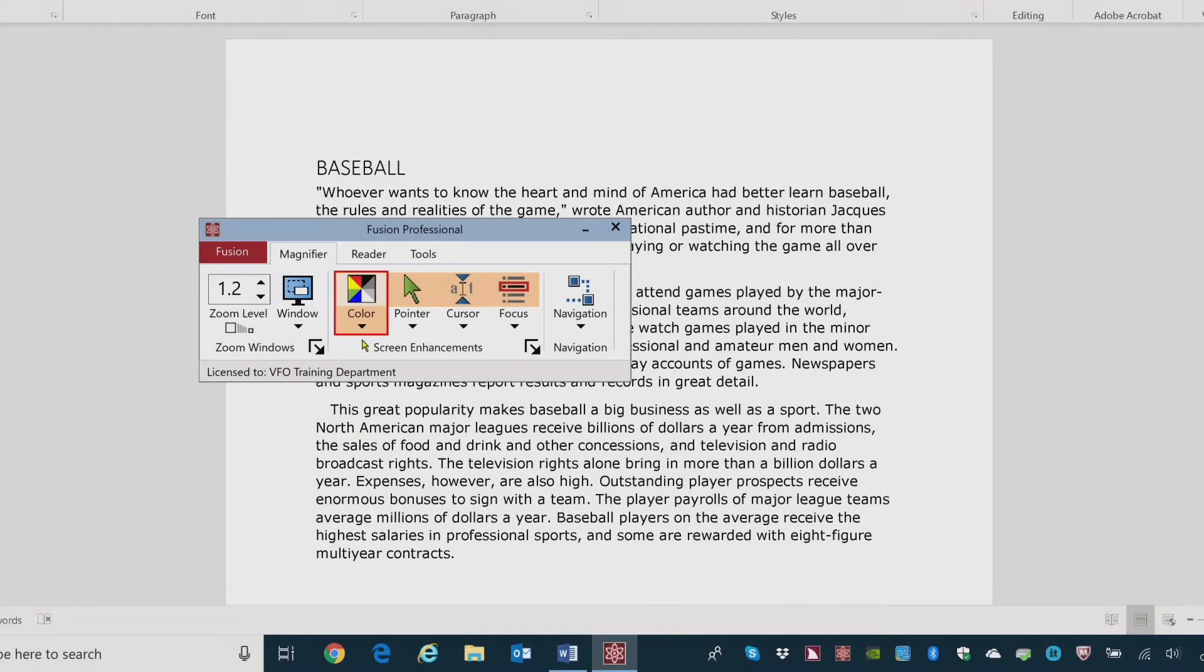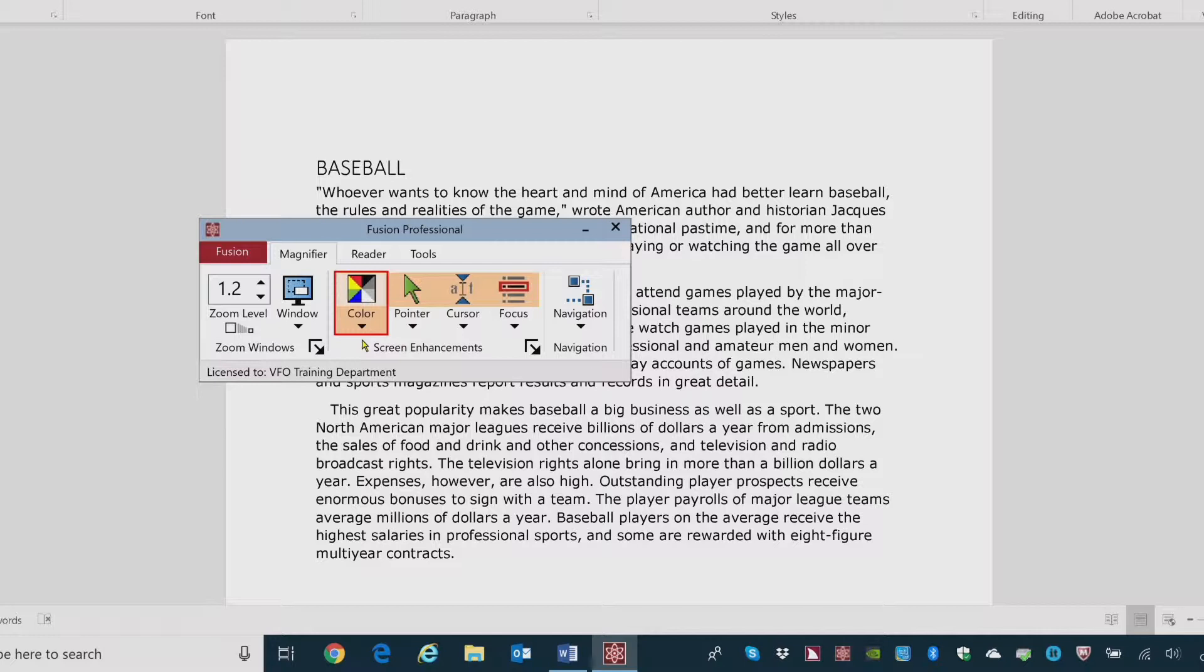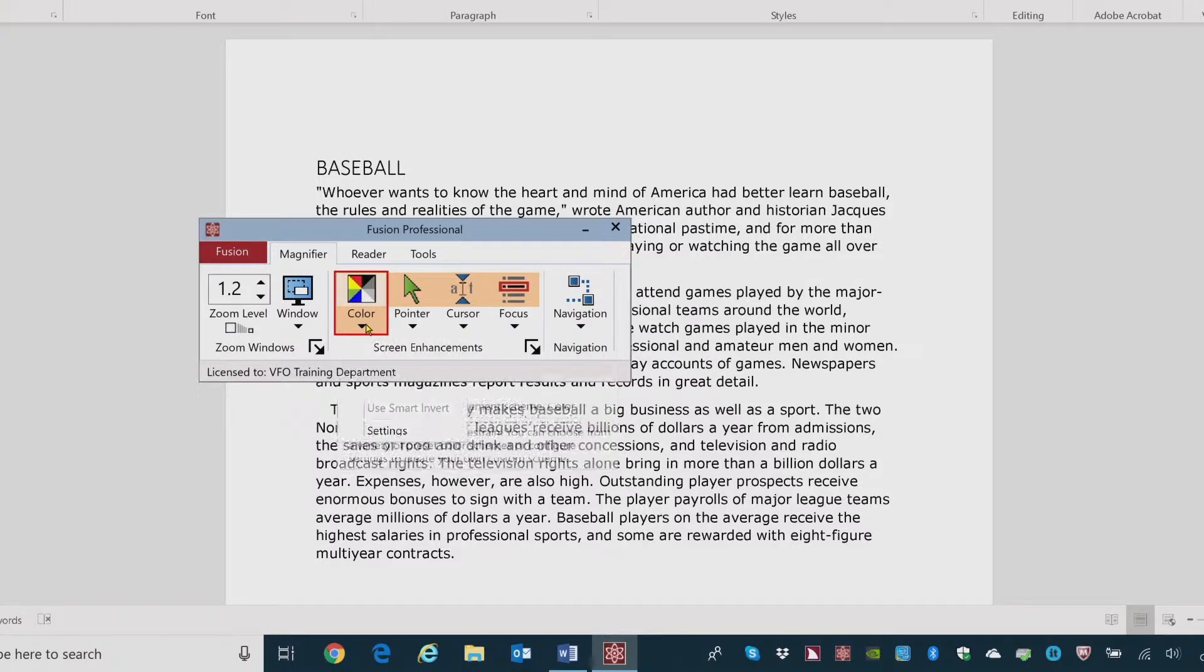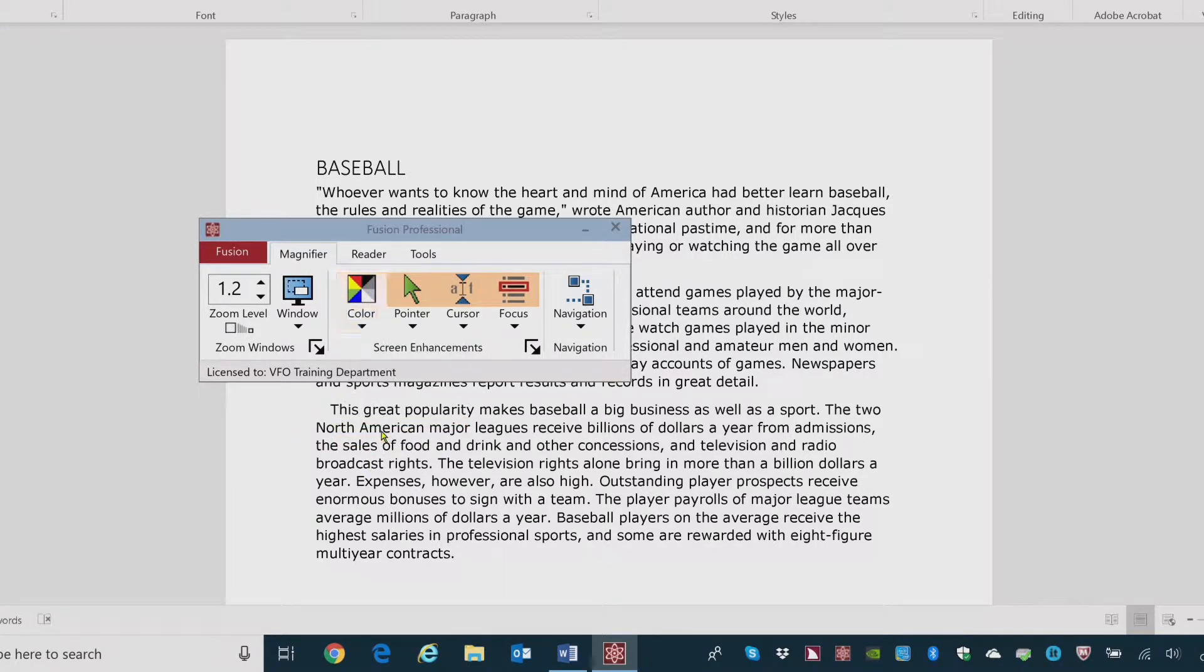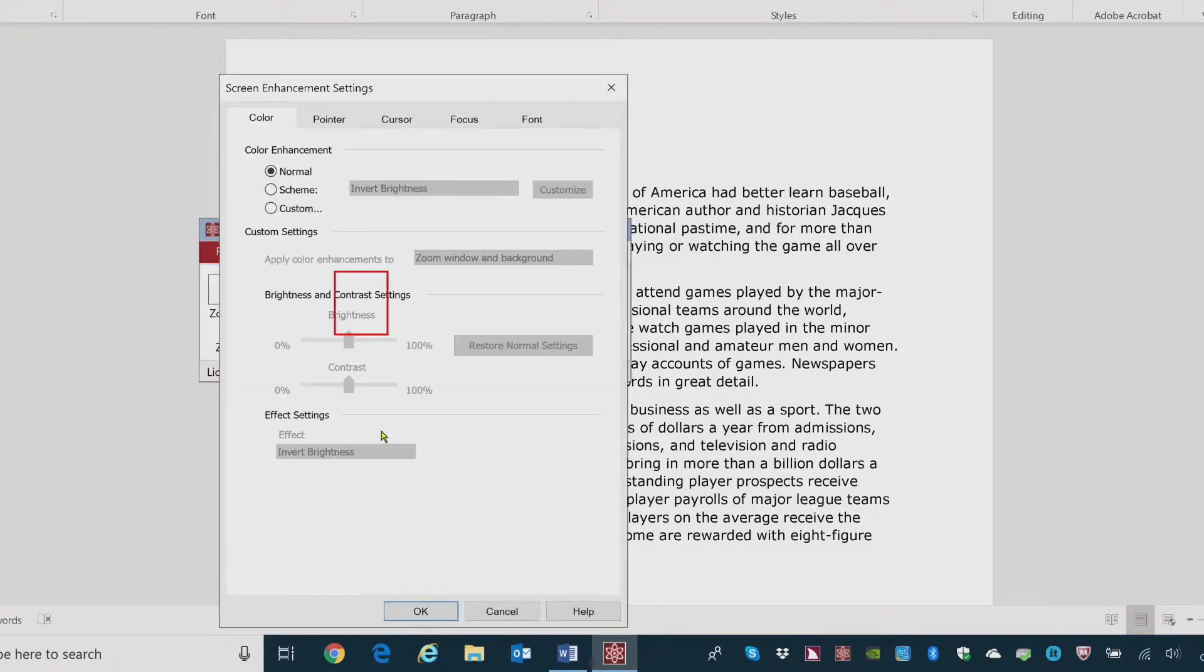To create a custom color scheme, on the Magnifier Toolbar tab, click the arrow next to Color. In the Color menu, choose Settings. Settings. Leaving menus. Screen Enhancement Settings dialog. Normal radio button checked, one of three. The Screen Enhancement Settings dialog box opens with the Color tab displayed.